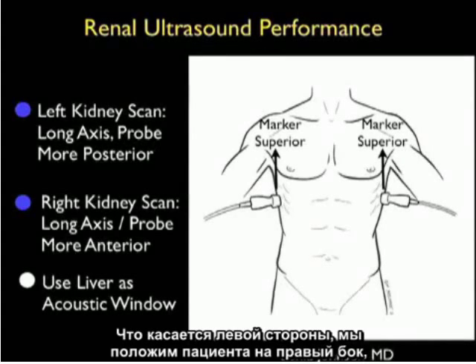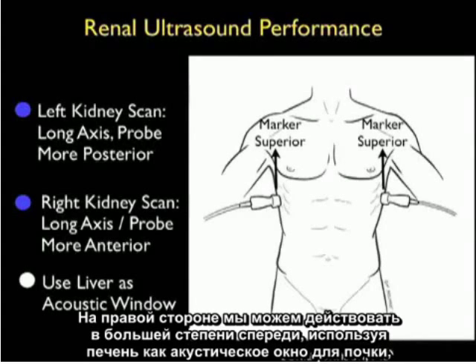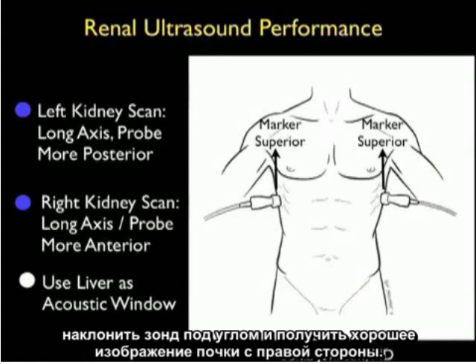For the left side, we want to put the patient in the right lateral decubitus position with the left side up so we can come in from that posterior position and image the kidney. On the right side, we can come in from a little bit more anterior, using the liver as our acoustic window onto the kidney. But it's also a good idea to put the patient in the left lateral decubitus position with the right side up so that we can angle the probe and get good views of the kidney from the right side.